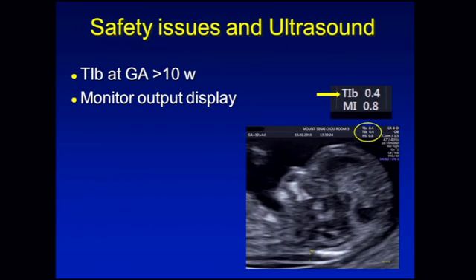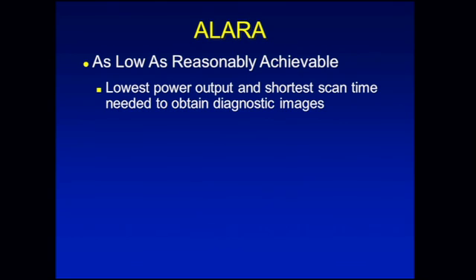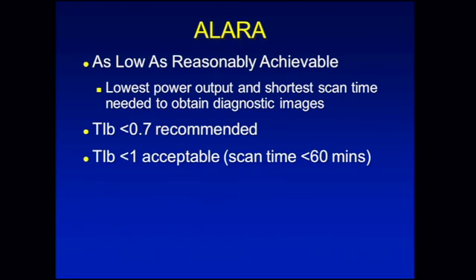0.4. We should also use the ALARA principle, as low as reasonably achievable. That is, using the lowest power output and the shortest scan time needed to obtain diagnostic images. A thermal index for bone of less than 0.7 is recommended.